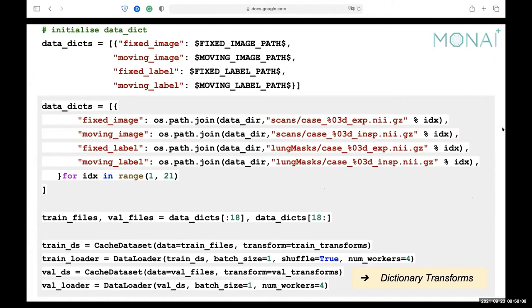This tutorial or example represents a general case of how those components could typically be used. The first step is getting a dataset. For an auxiliary supervised registration, we usually want two different image inputs and their corresponding labels: fixed image, moving image, fixed label, and moving label. The simplest way is to have a dictionary mapping each component to their path, then use that as input to create a cache dataset.